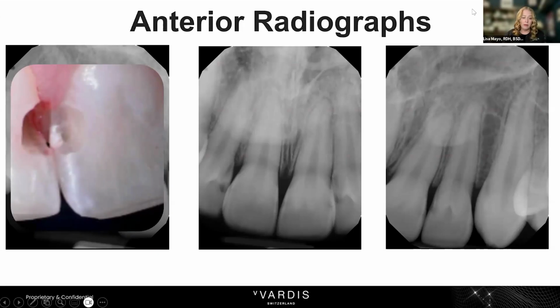But something I want to point out to you guys is if you look at the middle x-ray, I want your eyes to go to the interproximal region between 8 and 9. So Dr. Wynn turns to me and he goes, "Lisa, we're game over on the laterals, probably the distal of the centrals too. I got to do fillings," which I really hate in a 16-year-old because what's Braden's fate with number 7 and 8 by the time he's my age and he's 47? Do you really think he's still going to be having those fillings? Absolutely not. He's probably going to be in crowns at that point. So that's really what makes me cry as his mother and his primary dental provider.